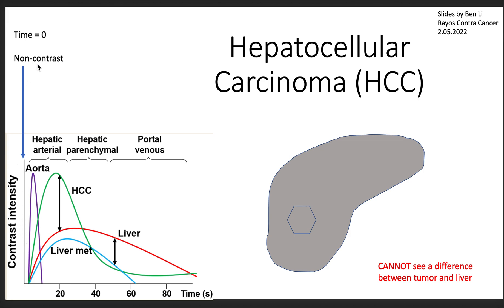Starting at time equals zero, the IV contrast has not had time yet to begin circulating through, so essentially this is without contrast. The liver all looks gray and pretty similar, so even if there was a lesion, we may not see it because it'll look the same as the rest of the liver.